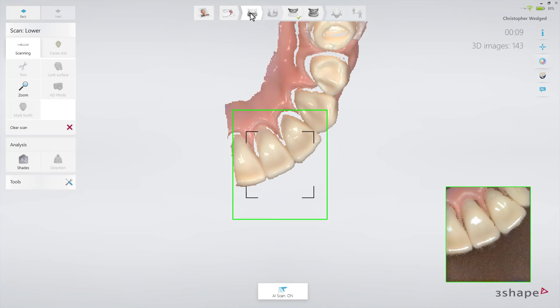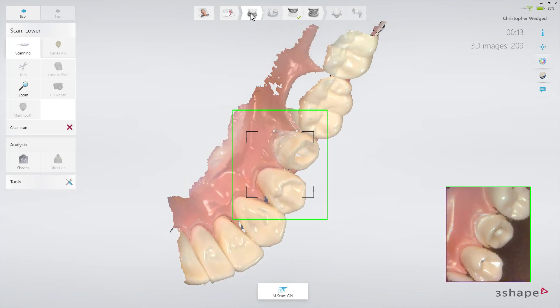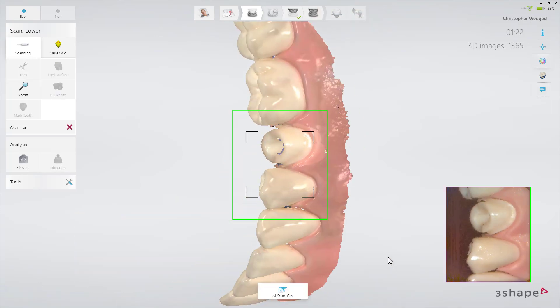Leave the retraction cord in place and scan the arch. Then trim away the margin in the scan using the trim tool. Remove the retraction cord, dry the teeth, and scan the margin immediately before the gingiva collapses.